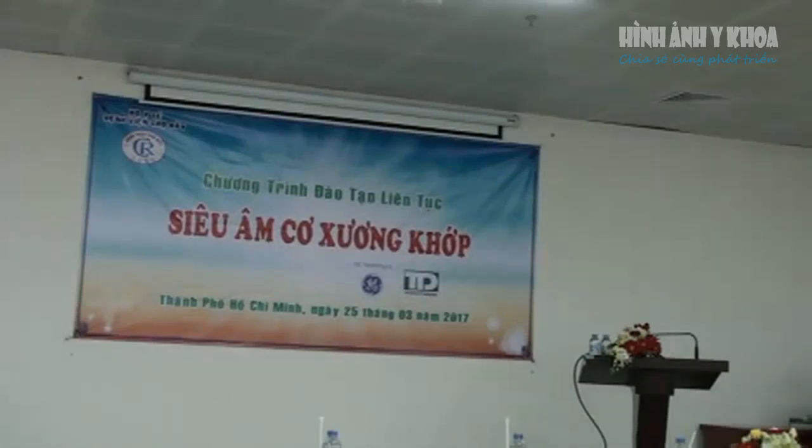Okay, so I'll just show you how I do my shoulder examination.